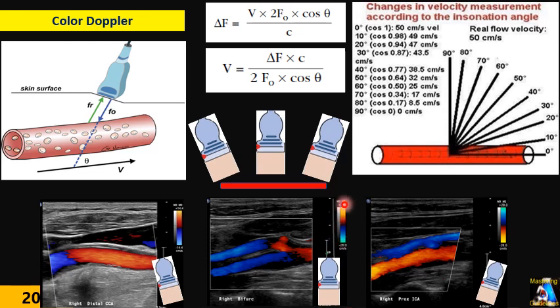So this is the vein. Here, as you notice, the color box scale has been changed. Normally, we do positive red and negative blue. But for the practical point of showing the artery as red and the vein as blue, sometimes you have to change it. Because here, if we put it as the normal standard, positive red, negative blue, this blood flow, which is the proximal ICA, becomes blue and gives the impression of a vein. To get over that, and because our mind is always set that artery is red and vein is blue, we change the color box direction here. Everybody, I hope, understands that. So here, just for showing, this is the vein and this is the artery, nothing else.